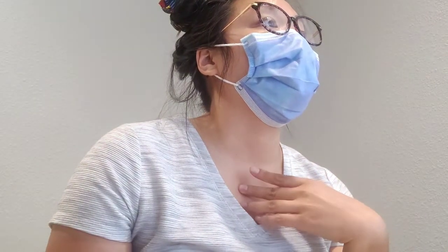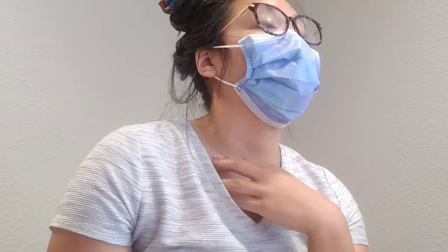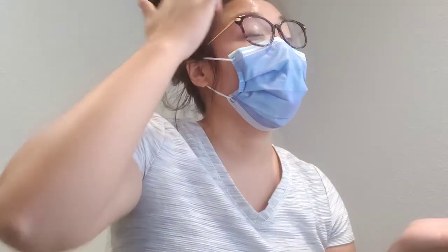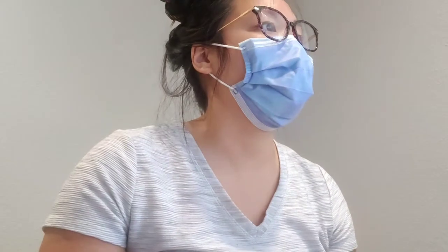Okay, next question. When performing a routine scan of the neck, which pitch would result in the highest resolution? See, I don't get this. So they're saying highest resolution, that means you want a clear image. So I put longer pitch, because the longer the pitch, the better the image would be. But the answer is, again, 0.7. I need to read into this. Keep getting it wrong. It doesn't explain why.